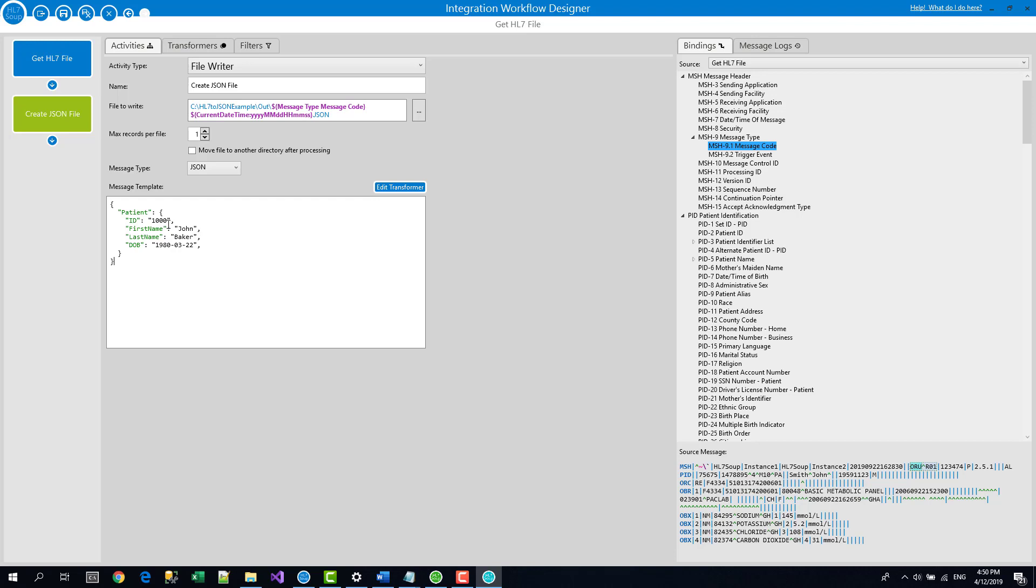So you can see in this JSON file, this patient with the ID, first name and last name and there's some sample values in there currently. We can actually replace those values with the variables just like we did in the file name. So with that ID, I can navigate to the patient's ID and I just drag that into the message and delete out that sample value.